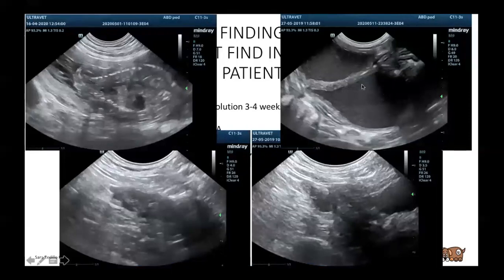Here we have a fetus, here a likely pyometra with a lot of content and dilated uterus. This was a spayed animal spayed later in life — in my opinion at the time it was probably a neoplasia: very irregular, pretty vascularized, very hypoechoic and heterogeneous. They didn't do further testing, so we can't confirm.